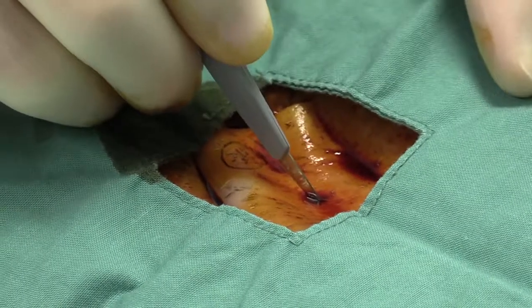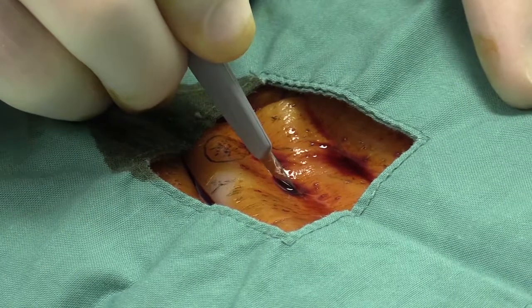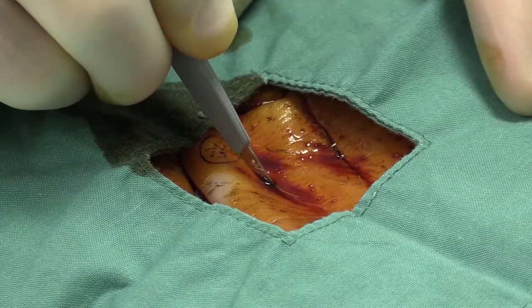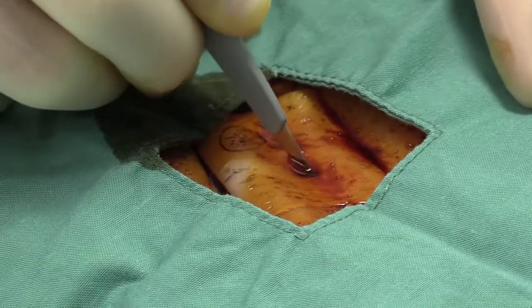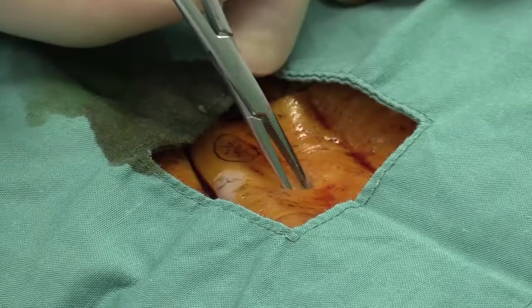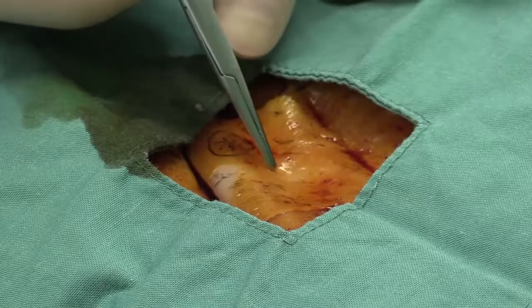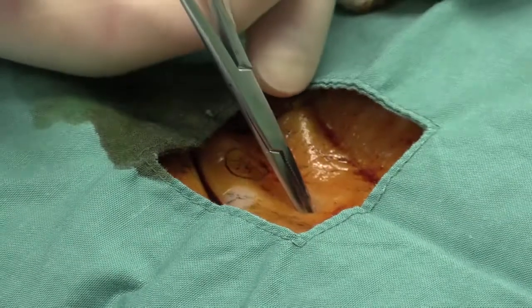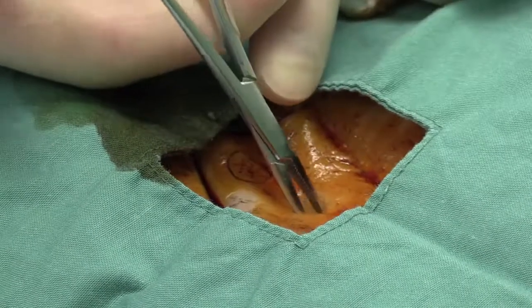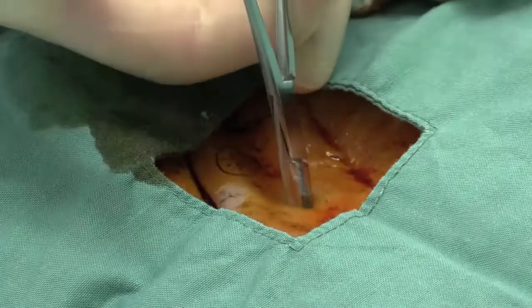So it is a puncture in and then drawing the blade across the skin to create an incision that is of sufficient length to accommodate both our catheter and also in this instance its first cuff, the cuff closest to the fenestrations in the distal extent of the catheter. Then we perform a gentle blunt dissection heading posteriorly.